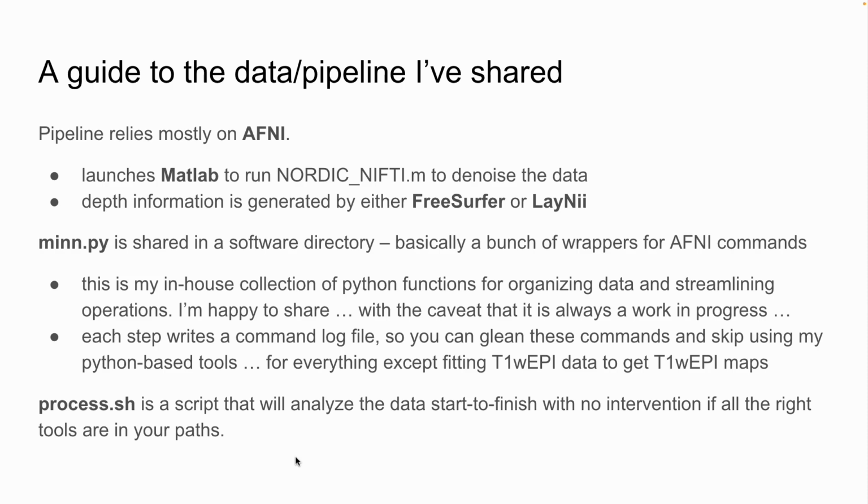Steen works some magic. And the idea is that we are pushing the limits of resolution, which means our voxels are getting smaller and smaller, and as your voxels get smaller and smaller, you move from the physiological noise-dominated regime to the thermal noise-dominated regime. So down at 3T with 3 millimeter voxels, you've got all the signal-to-noise ratio in the world you want.